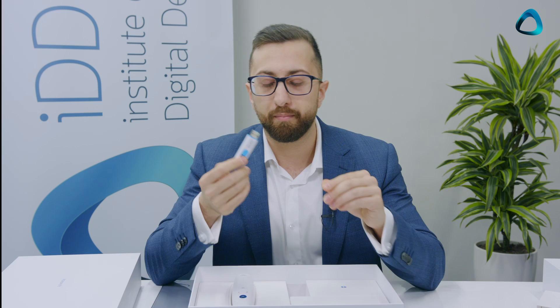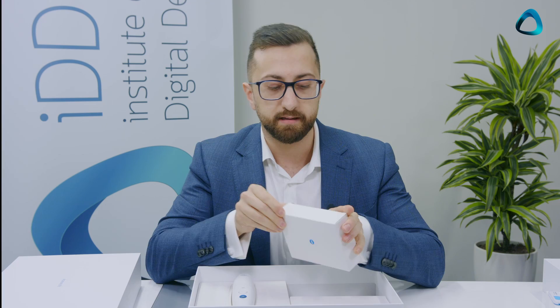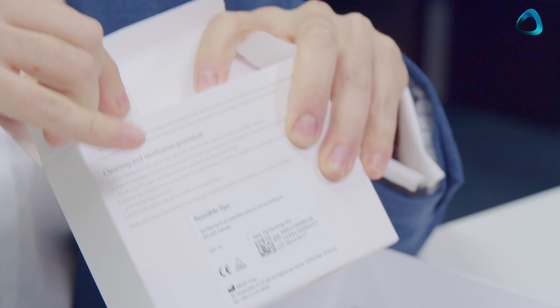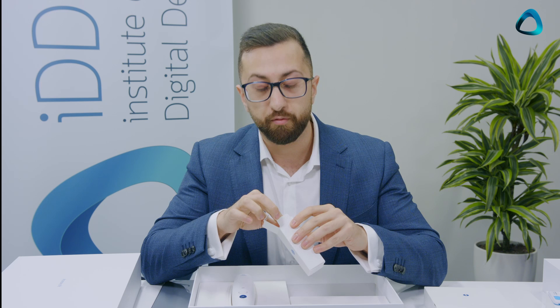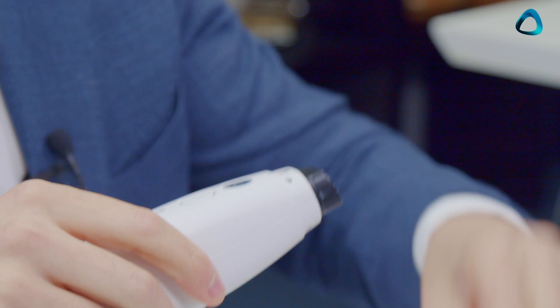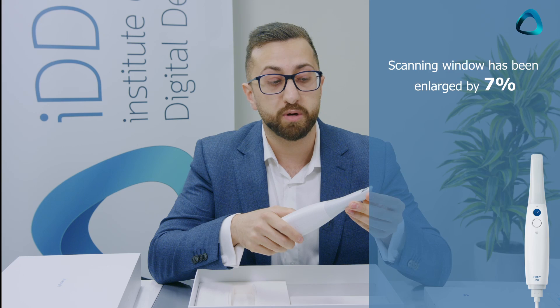In the scanner box you'll find a USB — mainly used for installing the software, which can also be done online. You also get four scanning heads. One downside of the Medit i500 was the limited number of autoclave cycles, but these scanning heads have been completely redesigned and can be autoclaved up to 100 times. The scanning head attaches simply — just push it on and it clips on. It's actually smaller than the i500 head, yet they've managed to make the scanning window larger. The window is also at a wider angle, around 45 degrees, making it easier to capture hard-to-reach areas.